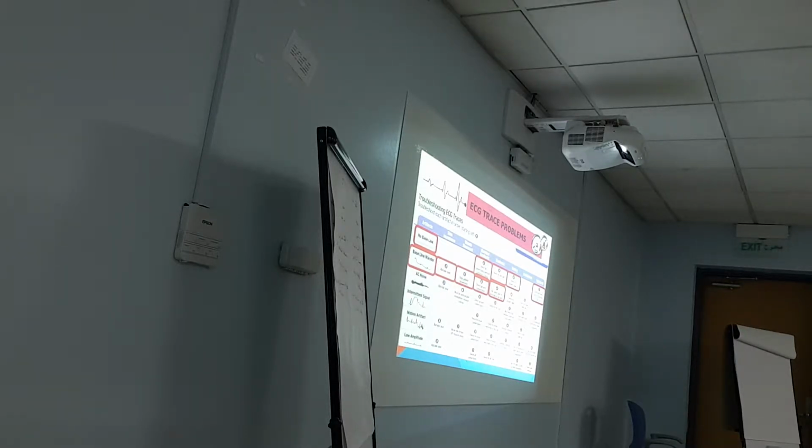Do not apply unless you have enough leads. You need how many leads? 10 leads. Okay, so you need to have 10 leads ready before. It's not attached already to the patient, with the same manufacturer.